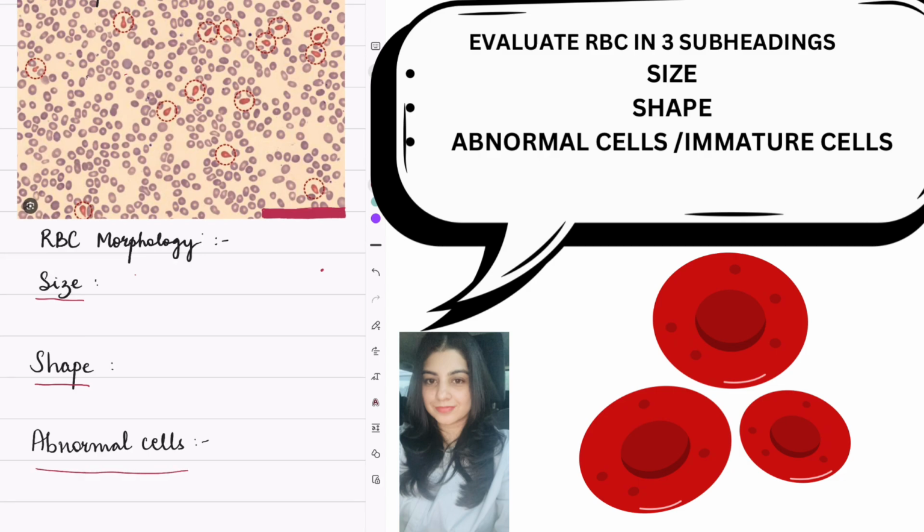Just about this slide, when you put it under 40x, this will be visible. Maybe this is 10x, not 40x. Okay, so 10 or 40, both. All right. So what do you see? First you will see the size. Start with the size. Imagine there's this small lymphocyte.